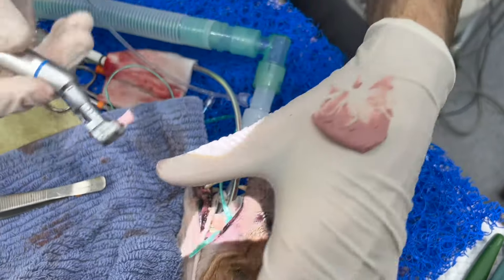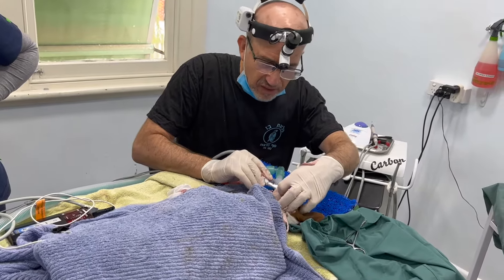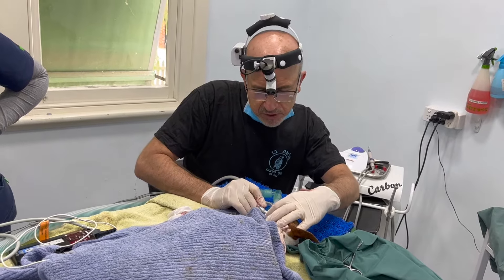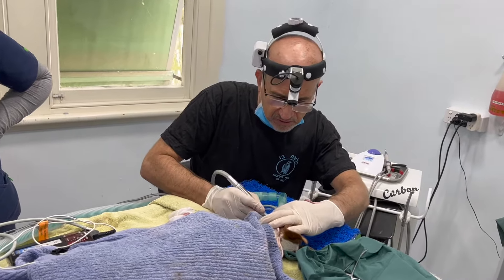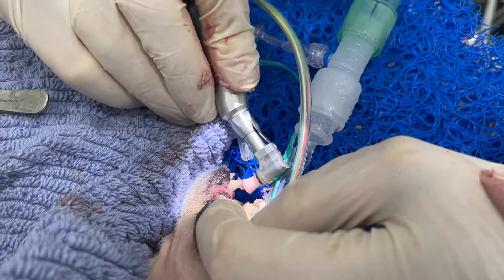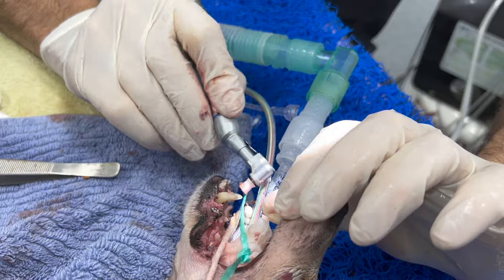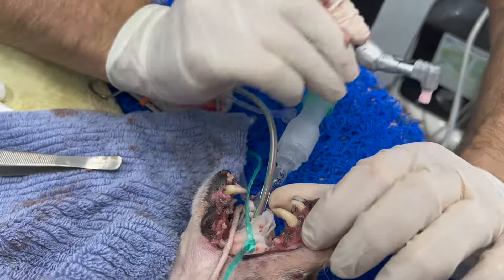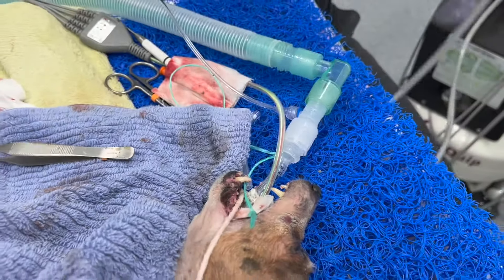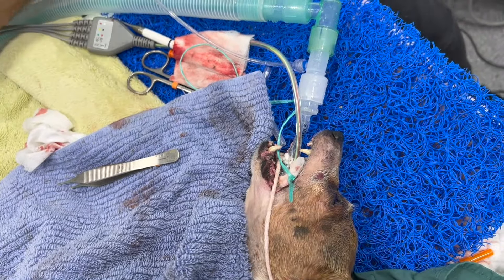Many of you watching will have had your own teeth polished at the dentist — it's pretty much the same thing. It's a bit like painting — we want to try and smooth the teeth as much as possible. You can see there's quite a fair amount of work involved in this.